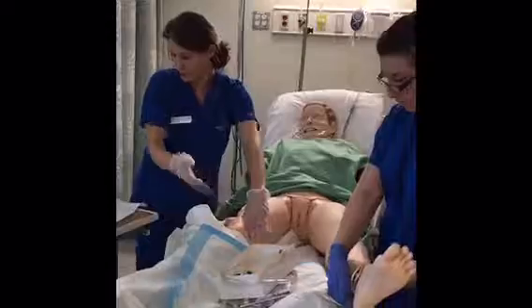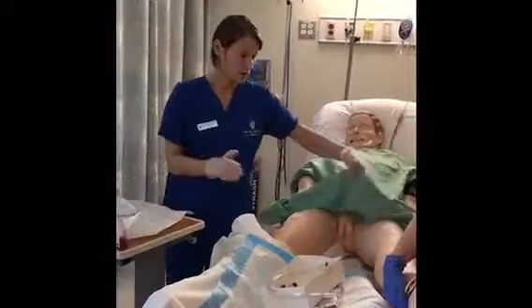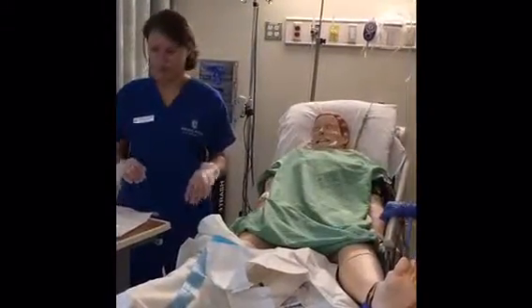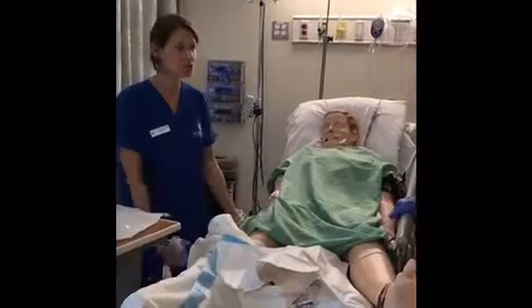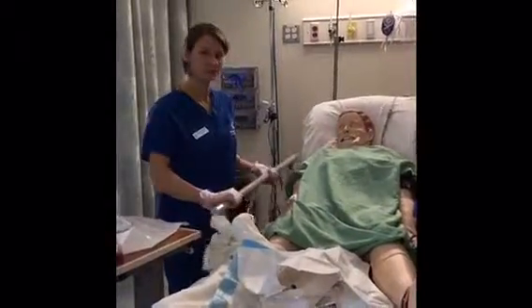And then I'm going to dispose of all my garbage, get my patient back to a comfortable position, clean up, and I would want my patient to void in the next 8 hours, and just keep assessing.